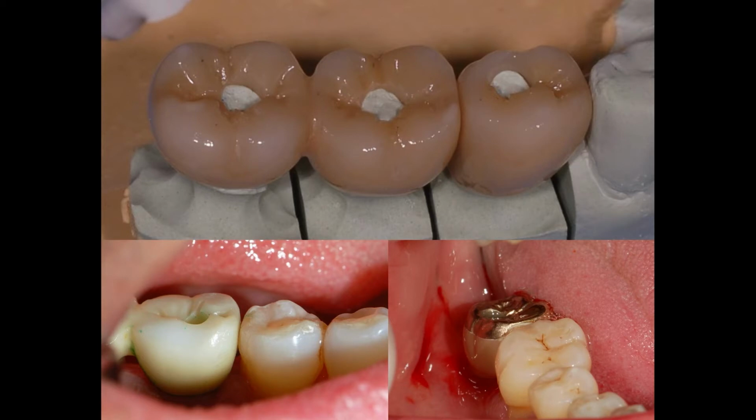Let's look at the next case. As shown in the top, it is very important to fabricate prosthesis aligning the marginal ridge, and this is completed through lab process. If you look at the lower left case, the marginal ridge height is different and the embrasure form seems very unfavorable. If you look at lower right case, the marginal ridge contour are aligned, but it is formed slightly high.